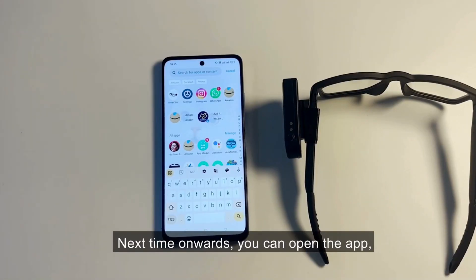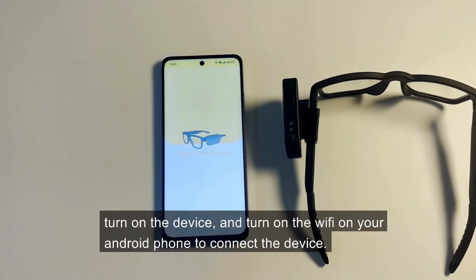Next time onwards, you can open the app, turn on the device, and turn on the Wi-Fi on your Android phone to connect the device.